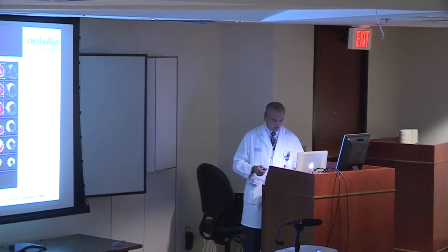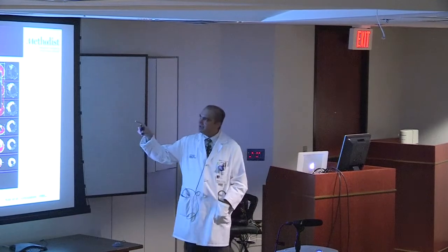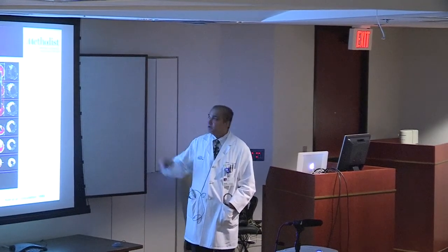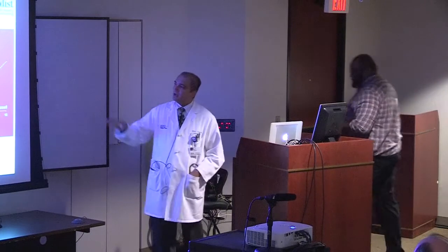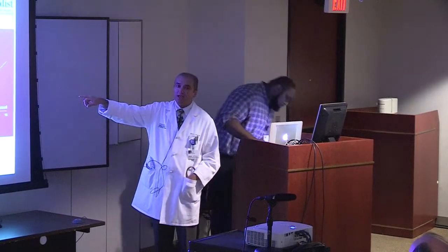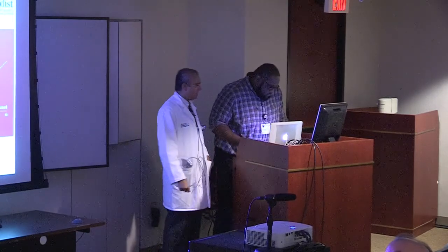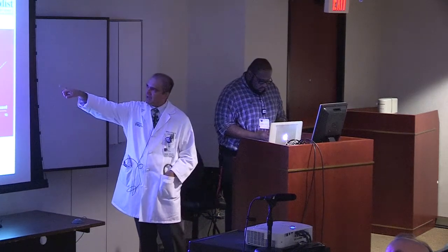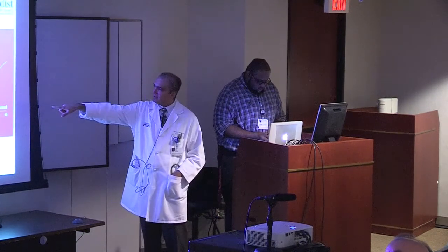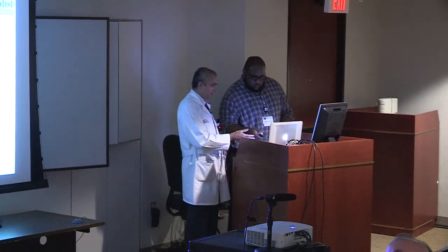see on TTC staining. And in fact, if we take a look at one of these views and blow it up, you can see that the CMR gives you an almost exact match to what you see histopathologically. And in fact, this study demonstrated that whether the MRI was performed 1 day, 3 days, or 8 weeks after ligation and creation of the acute infarction, the size of the MRI hyperenhancement very closely matched the size of the infarct by histology.